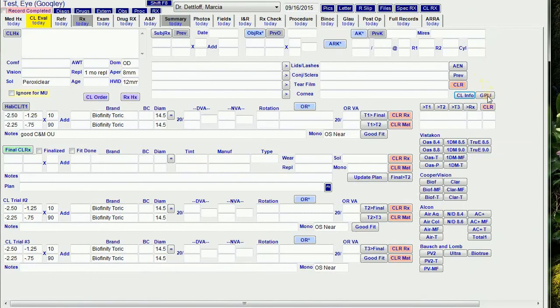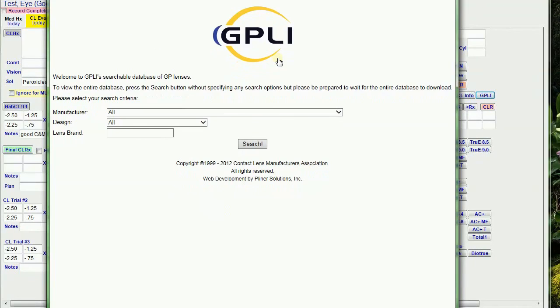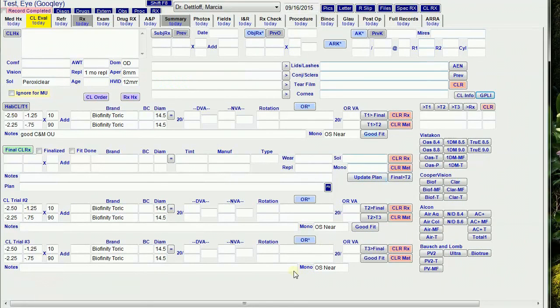And the GPLI button opens up the GPLI website. We're going to search for gas permeable lenses. And I think that's it for the Contact Lens tab.